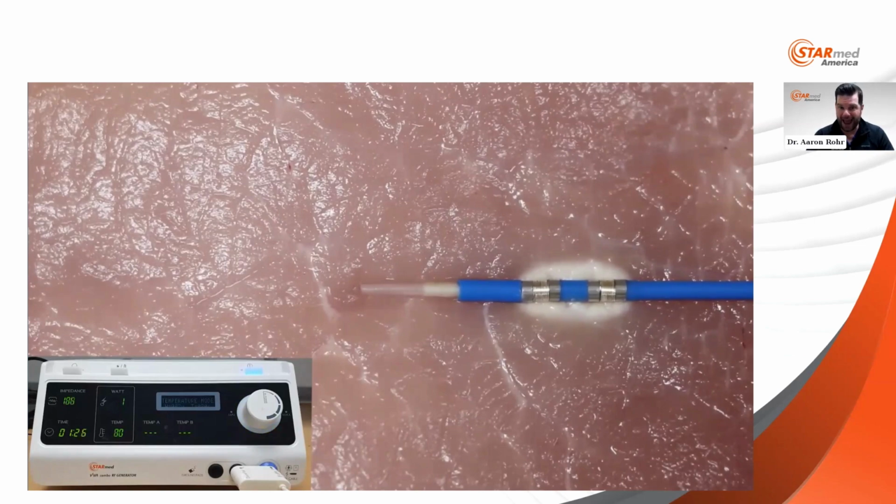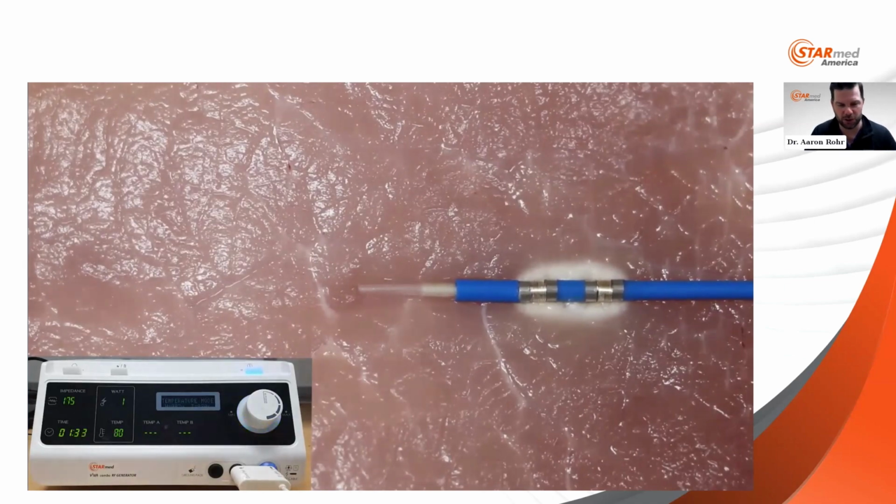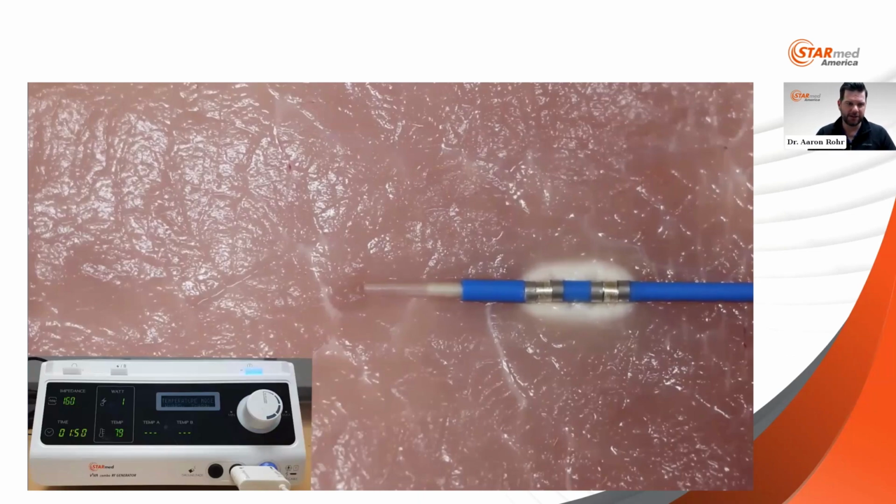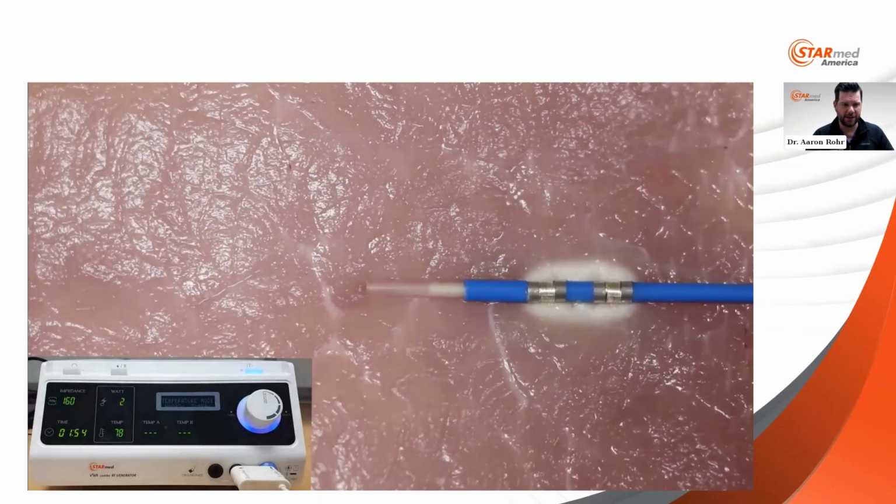That's just out of A, habit, and B, out of the manipulations between the drain, the wire, the catheter, etc. And we'll get into a little more specifics on the types that we use for this procedure. But this is, again, the general overview of what 2 minutes looks like, and you can see the focal area of treatment, specifically with this 11 millimeter device. And as you can see here, we're coming to an end at 2 minutes, and the impedance and everything staying pretty consistent.